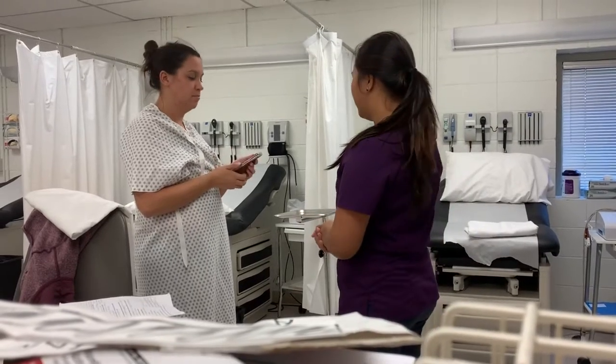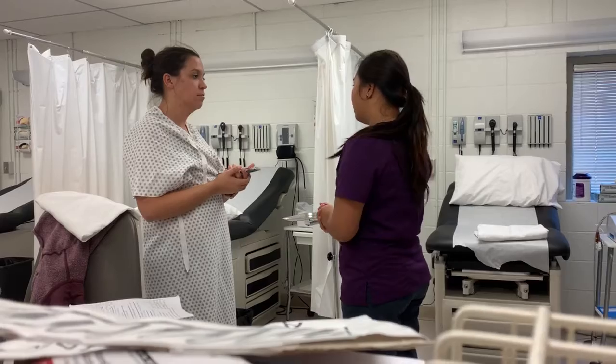When my patient is ready, is it okay if we proceed to the test?